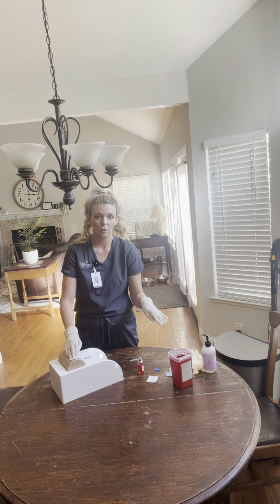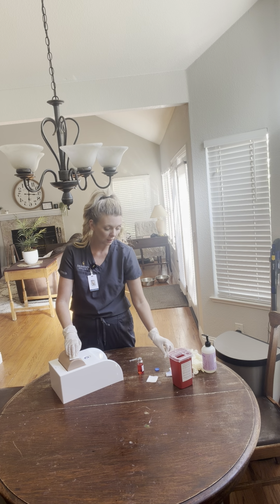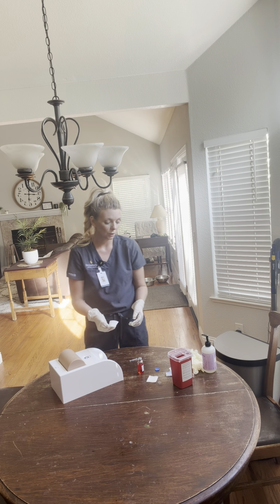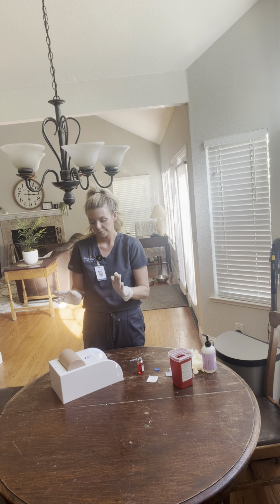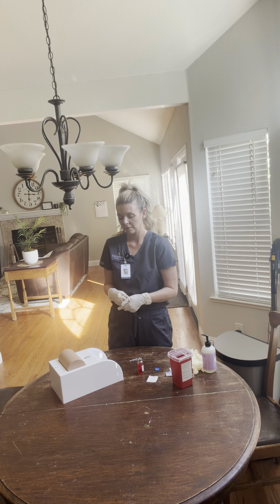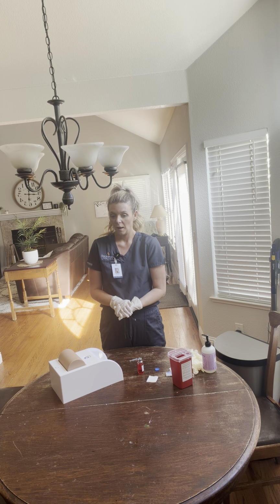I'm going to dispose of my needle in the sharps container, and I'm going to monitor my patient to see if there is any bleeding. If there was continuous bleeding, then we could place a bandage. Right now, my patient looks good. I'm going to ask them if they have any questions for me, how they're feeling, if they're doing okay.